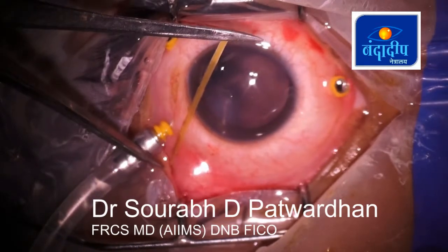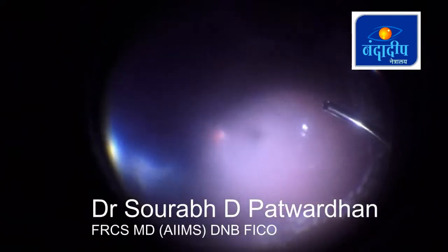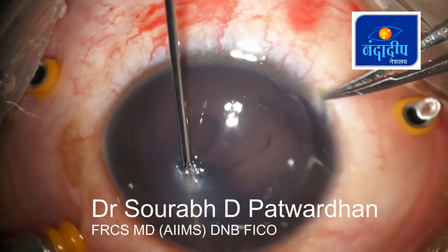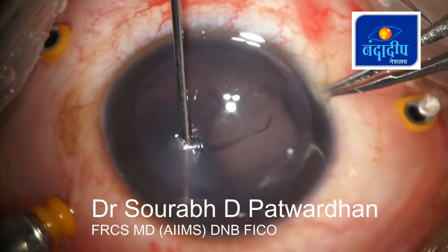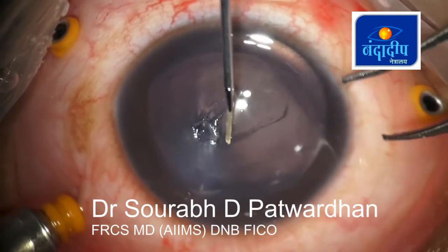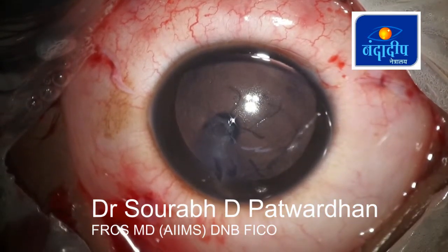Luckily, it had not hit any of the critical structures as I had mentioned before. There was a small piece of foreign body left in the cornea which I noticed at the end, so I used 25-gauge intravitreal forceps to remove this small chip of wooden foreign body which was impacted in the cornea, thus avoiding extension of the wound.